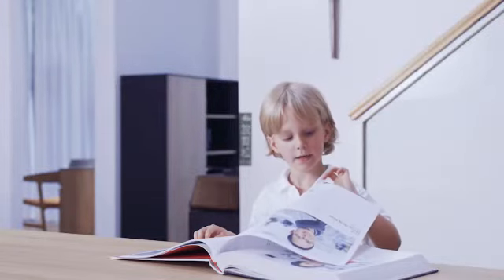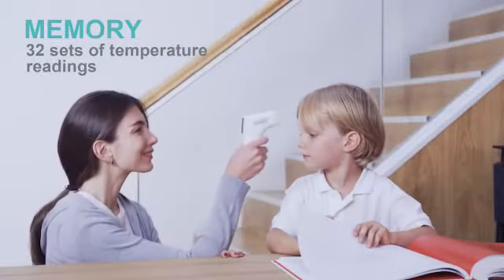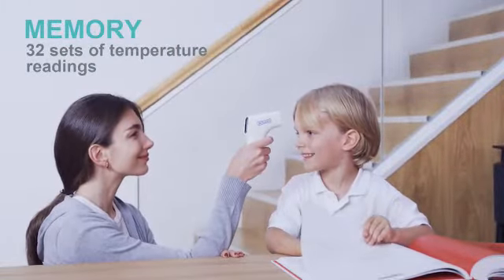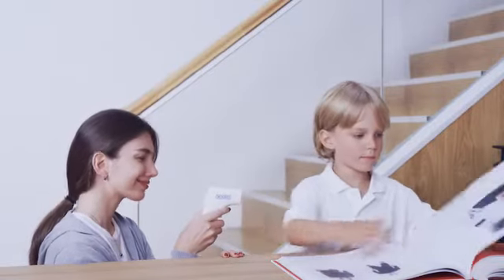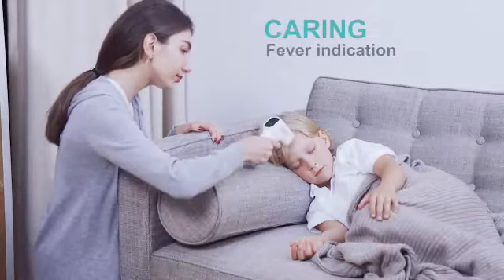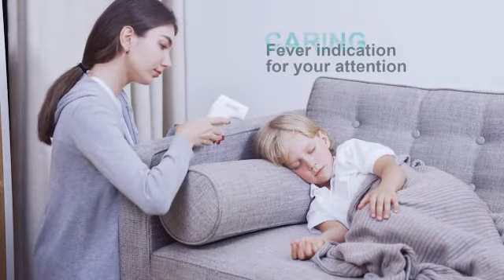Memorizing 32 temperature readings for easy comparison of your child's temperature over time, so you can feel confident keeping a close eye and staying on top of things. There is a fever indication whenever an elevated temperature is measured, so you can know right away.